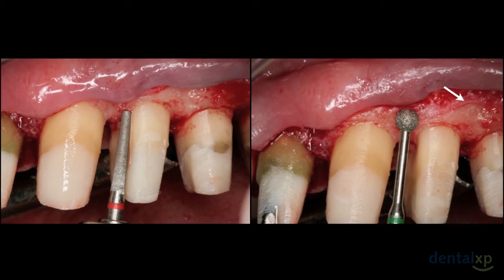The arrow that you now see is located to show you where the periosteum is when I've reflected my flap. What I'd like to do is always save periosteum because it will be the material I use to suture my flap to.